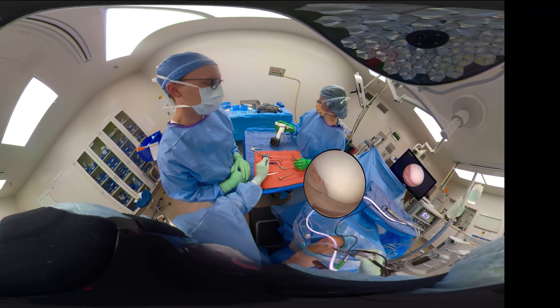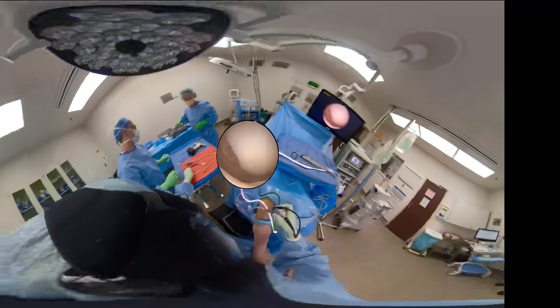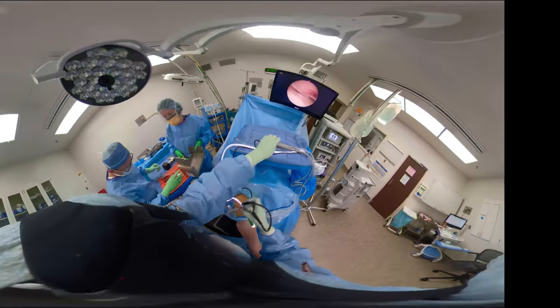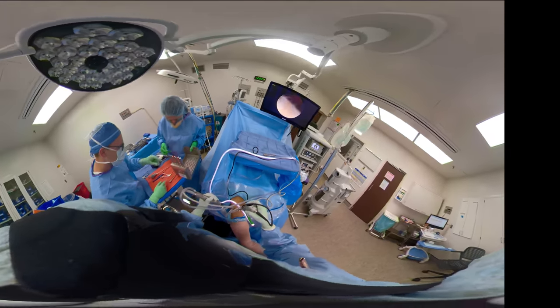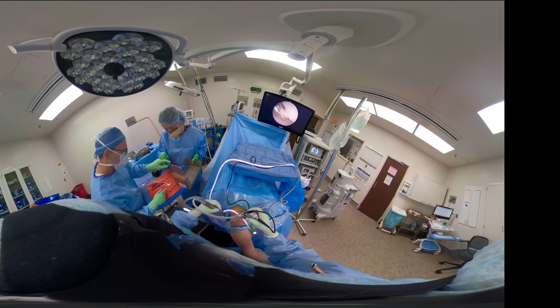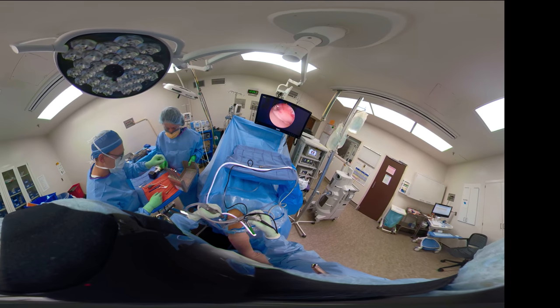And now you can see we've got a drill with a smooth K-wire there. 4-5, and we'll triangulate to make sure we can get perpendicular to that defect. Again, there's a big enough portal there where now I can bring in my curved shaver and finish the debridement of the defect, preparing it for the microfracture.